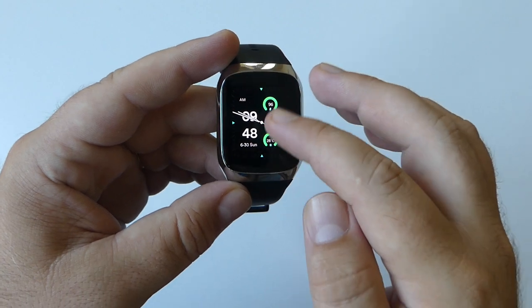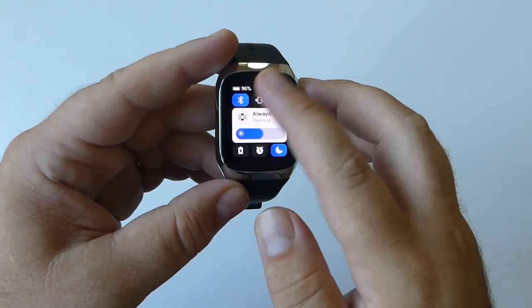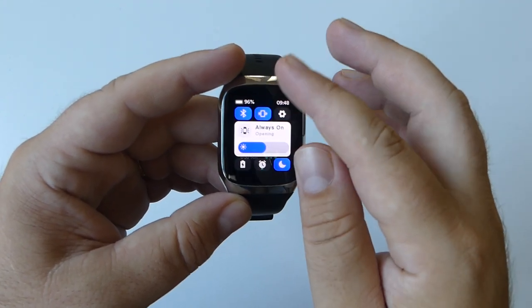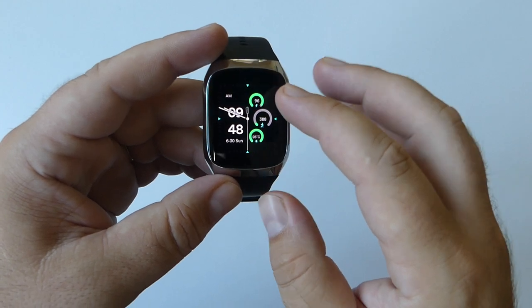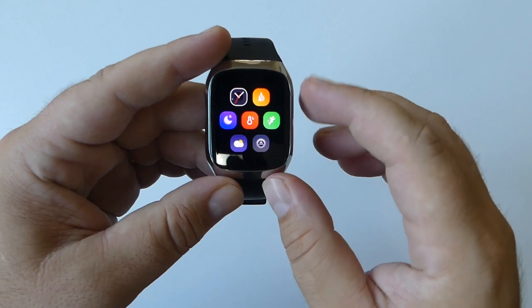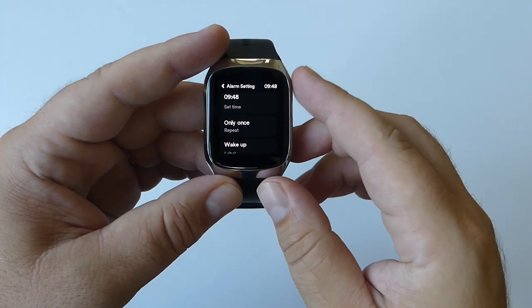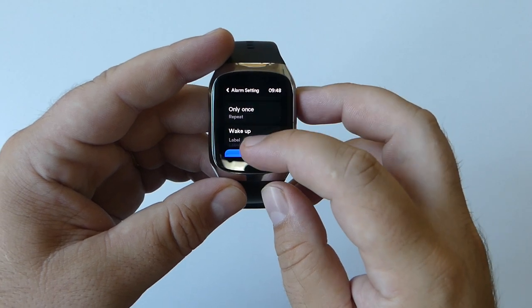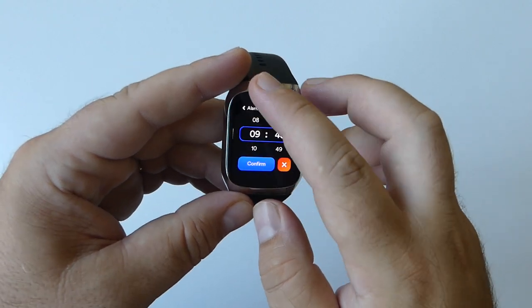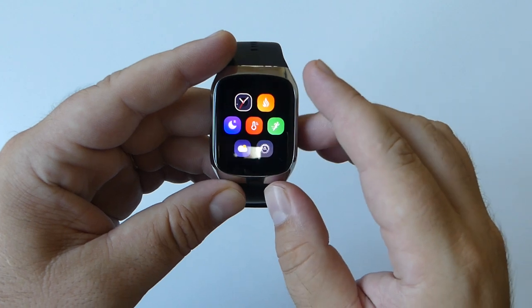As a smartwatch, BP Dr. Med provides all the essential functions you'd expect, such as push notifications, call alerts, reminders, and vibrating alarms for a more convenient and efficient life. You can also set a vibrating alarm directly on the watch to gently wake you at the desired time, without needing to use your phone.